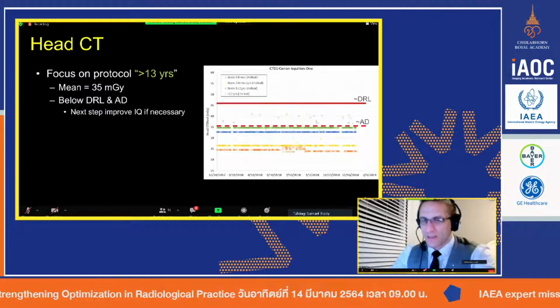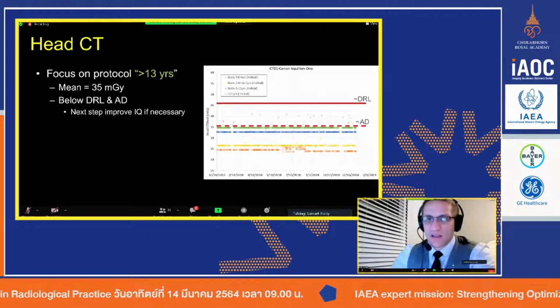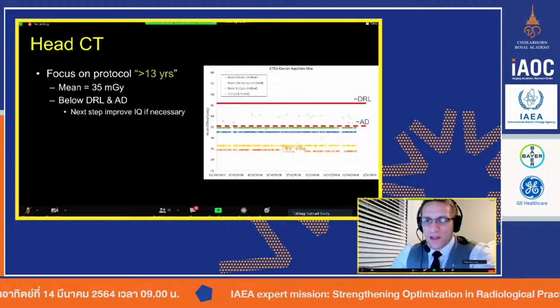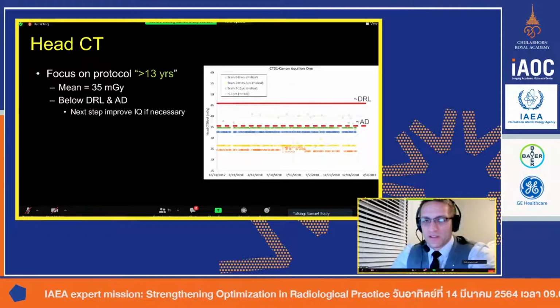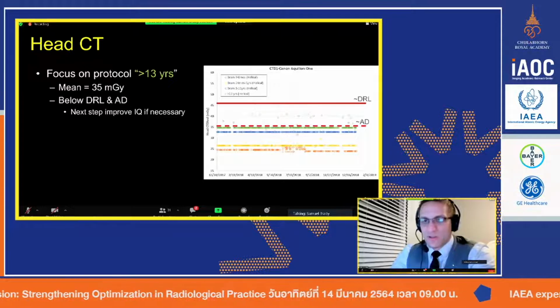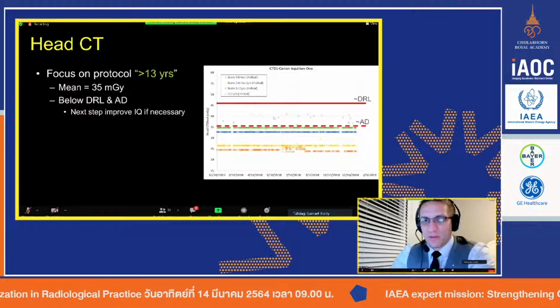Once again, the 75th percentile of the data you saw on the previous slide, all of our values are below that. And when I apply the 50th percentile, the potentially achievable dose for pediatrics, for all intents and purposes, most of our data is below that, but there are some data points that every so often will just pop up above it.